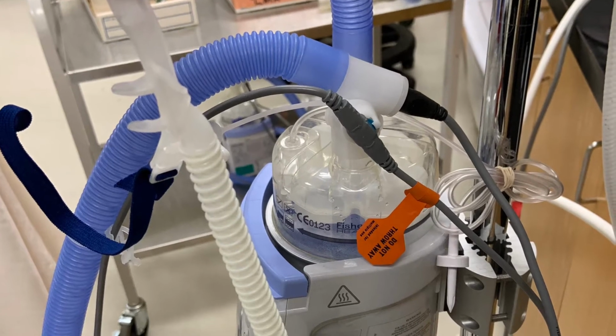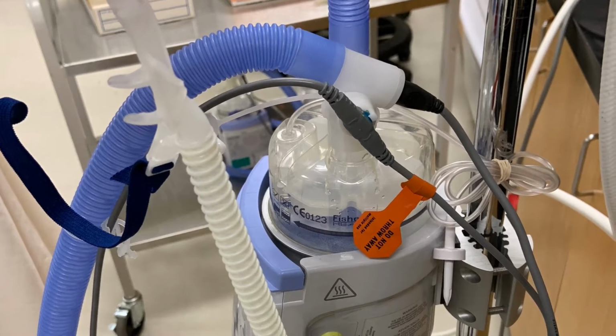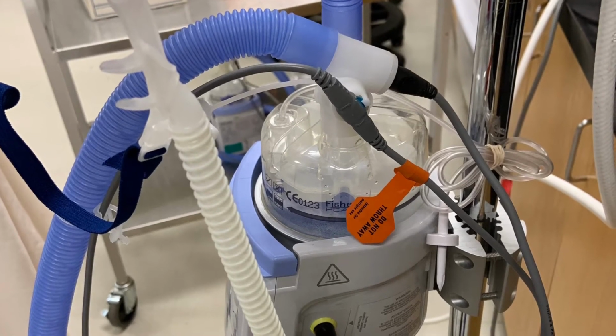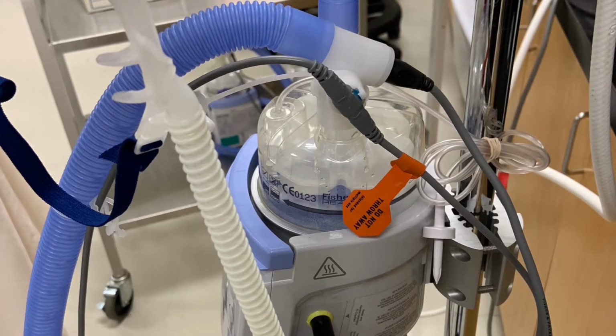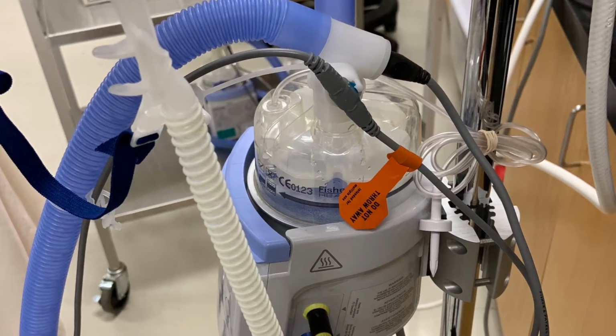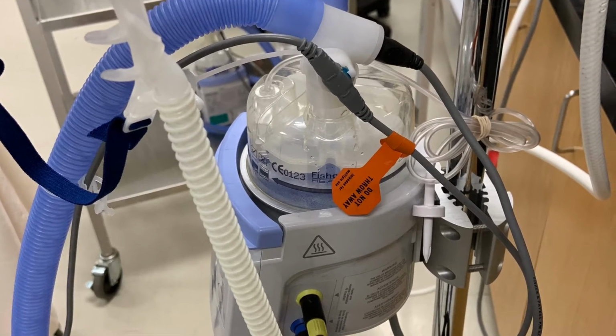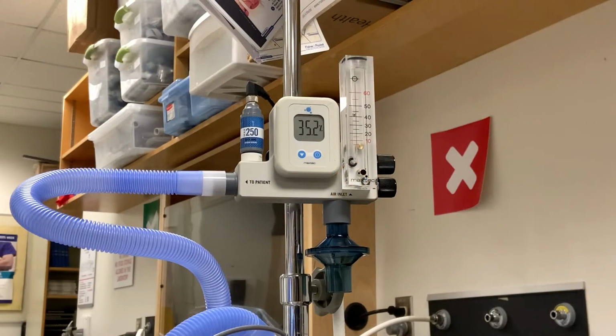Also, you must connect the nasal cannula to the humidification circuit before you set oxygen percentage, because this device creates resistance to gas flow and will change oxygen percentage leaving the device. Note the change to the measured oxygen percentage once I connect the nasal cannula to the system.